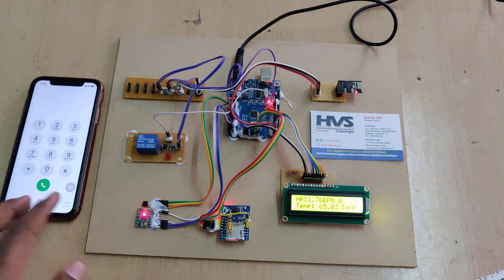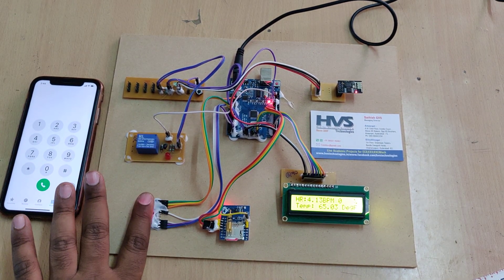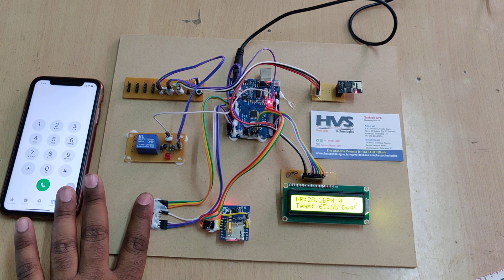Now place your finger on the MAX30100 sensor module and you will get the health parameter data — heartbeat and SpO2 — displayed on the LCD screen.